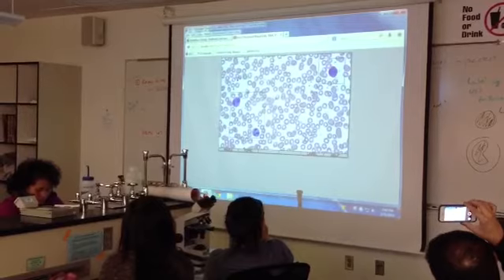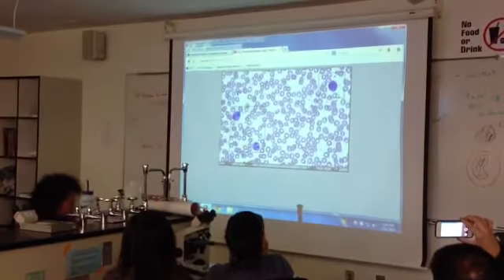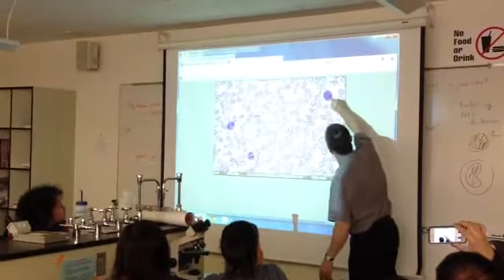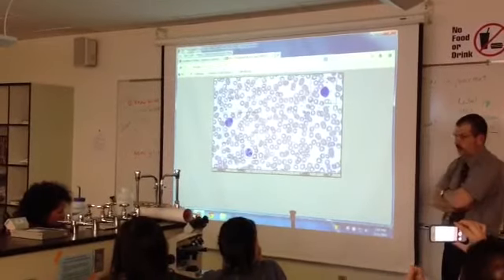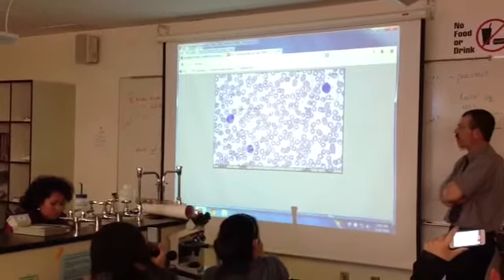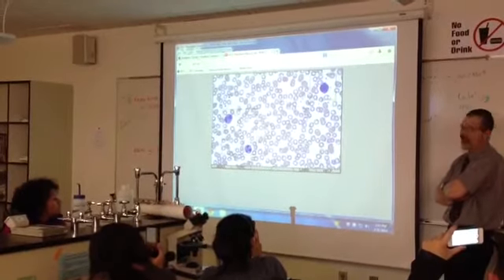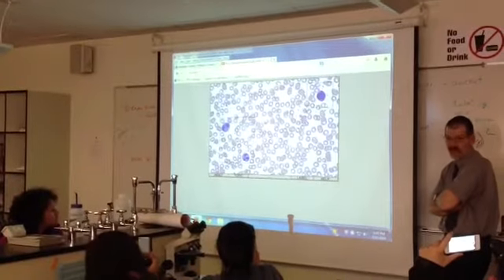In fact, they're so speckled, you can't see anything but speckles. Right? So you won't see a nucleus. There's one in there. But it's going to be just ink blob kind of shape. Very distinctively dark speckles. That's the most rare, less than 1%. Hint, hint. In my years of doing this, it's very hard for me to find one of those on a slide if I don't want to spend 3 hours looking for it. So the chance of me finding one on a slide and putting it on your test is based upon how much time I want to be here, which is not as much as you think.